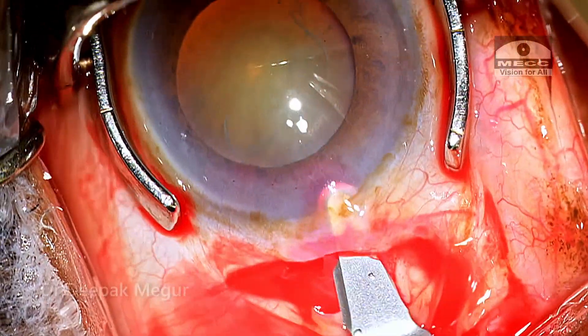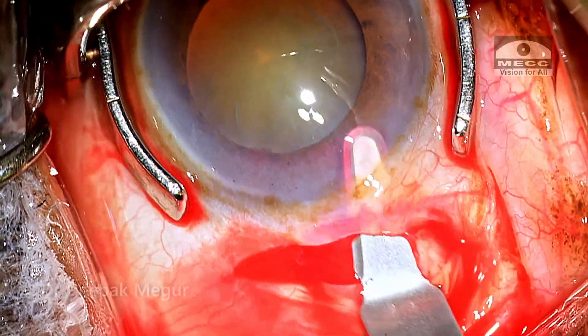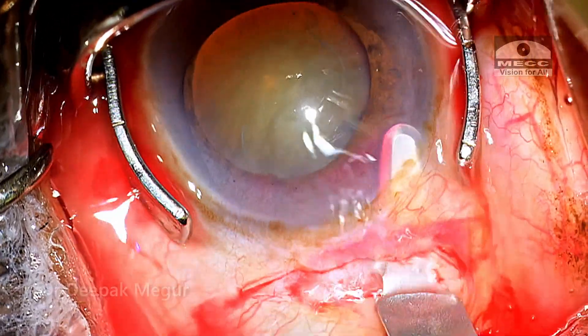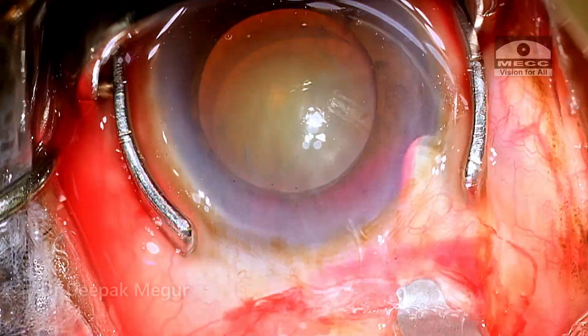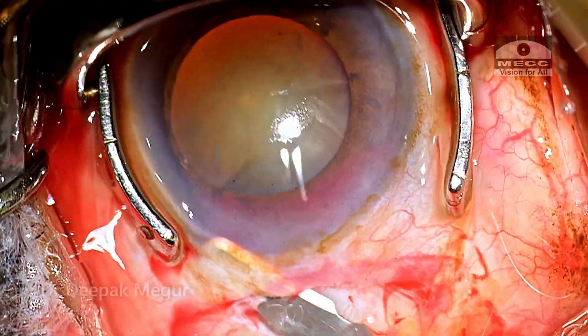Constant irrigation and also active aspiration by my assistant using a suction pump helps to keep the field clean and also enhance visualization. A decent size sclerocorneal tunnel is created.